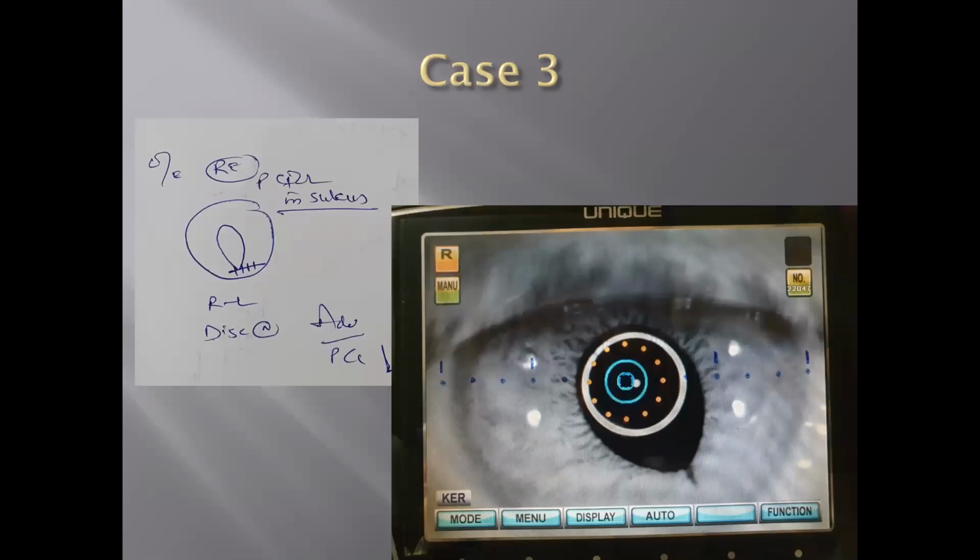Like this patient was operated for a corneal tear first in the right eye about 4 months back, and about 2 months back, the patient developed cataract. As you can see, the scar of the corneal tear is visible in the illustrated figure, while this is an autoref figure in which you can see there is a trauma to the sphincter muscles also at 5 o'clock position.